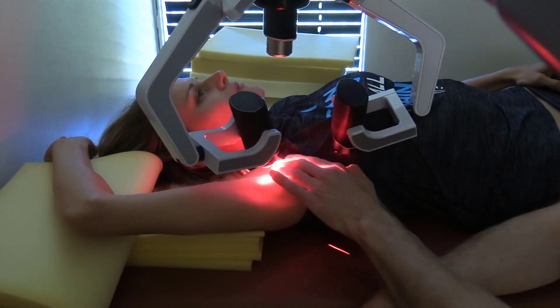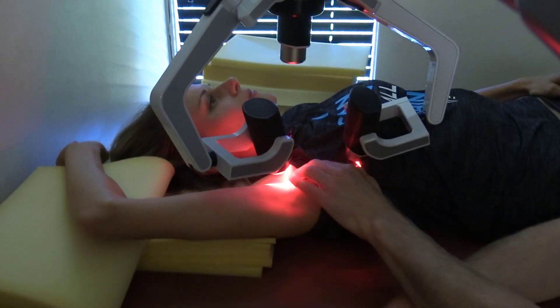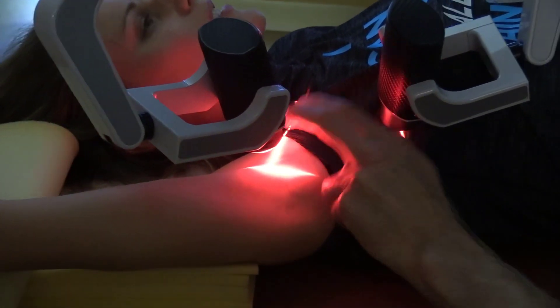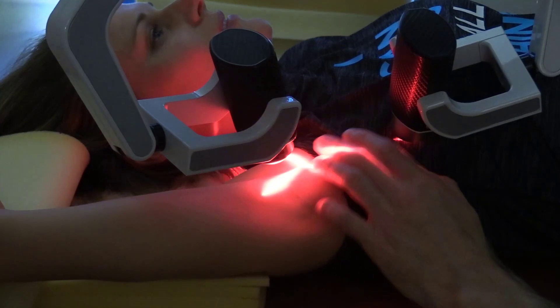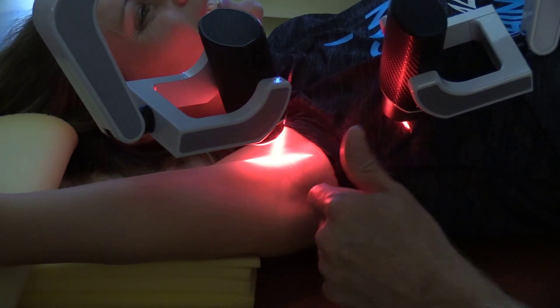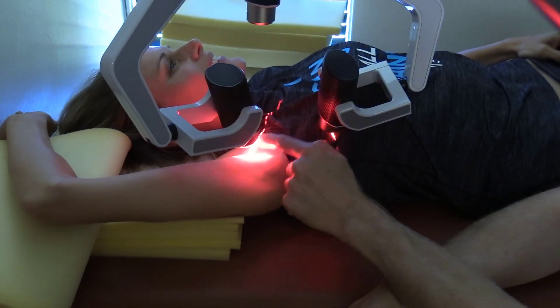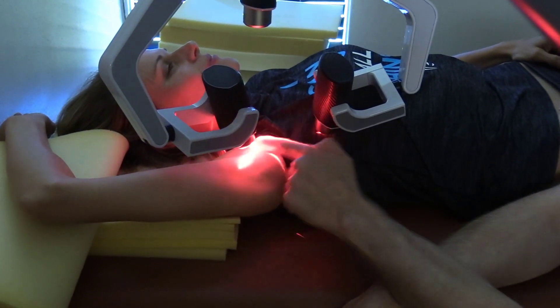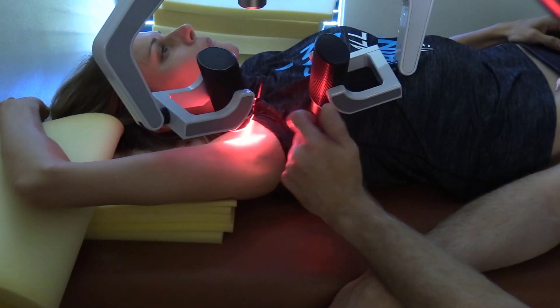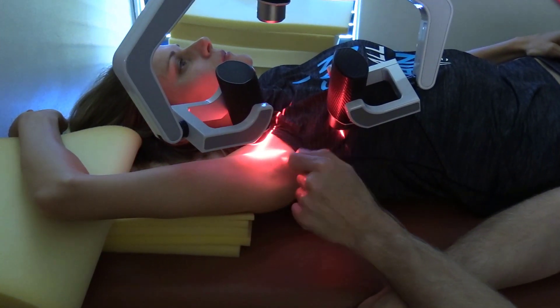It's kind of impossible for me to get to it right now, but it's right under here. If you want the person to feel it, you just kind of zing it, tap it a little bit. [Patient confirms feeling zinging down her arm.] It's like a funny bone sensation. For some people it's really bad — you just go in there lightly touching it and it hurts. That neurovascular sleeve holds all the nerves going down the arm. If that gets entrapped up here, which is a common entrapment point, it can cause symptoms of tingling and numbness. The other spot this commonly happens is in the scalene muscles, which we'll cover later.